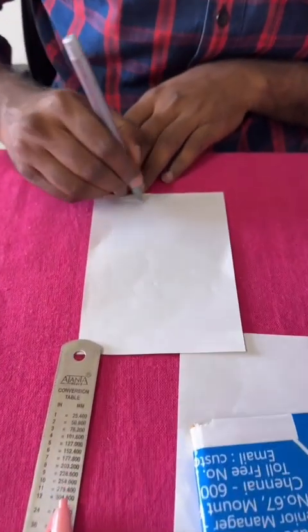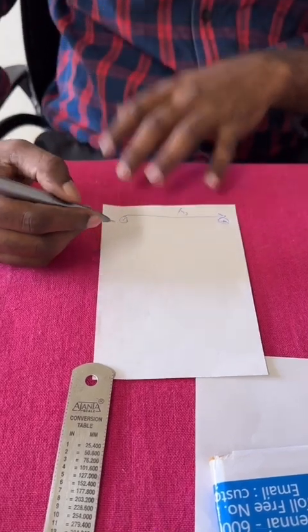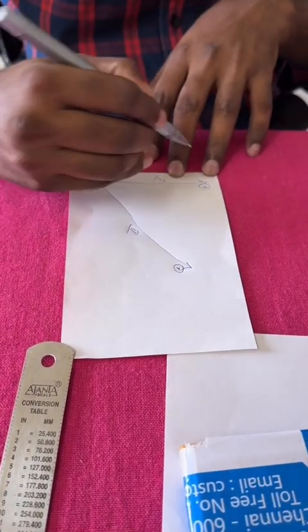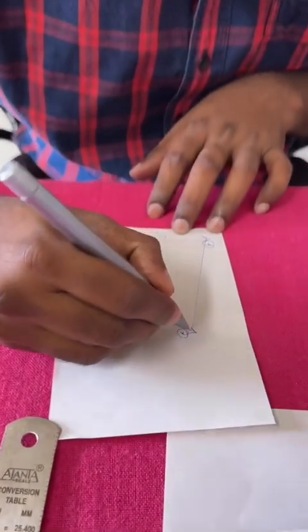About ECG reads. What about the ECG? So the three-dimensional. Okay. So we are here having lead 1 from the right arm to the left arm. So it will be like this, in this direction we have lead 1, and we have lead 2 from the right arm to the left foot. Okay, so this will be in this direction. This is lead 2, and we are having lead 3 from the left arm to the left foot in this direction.